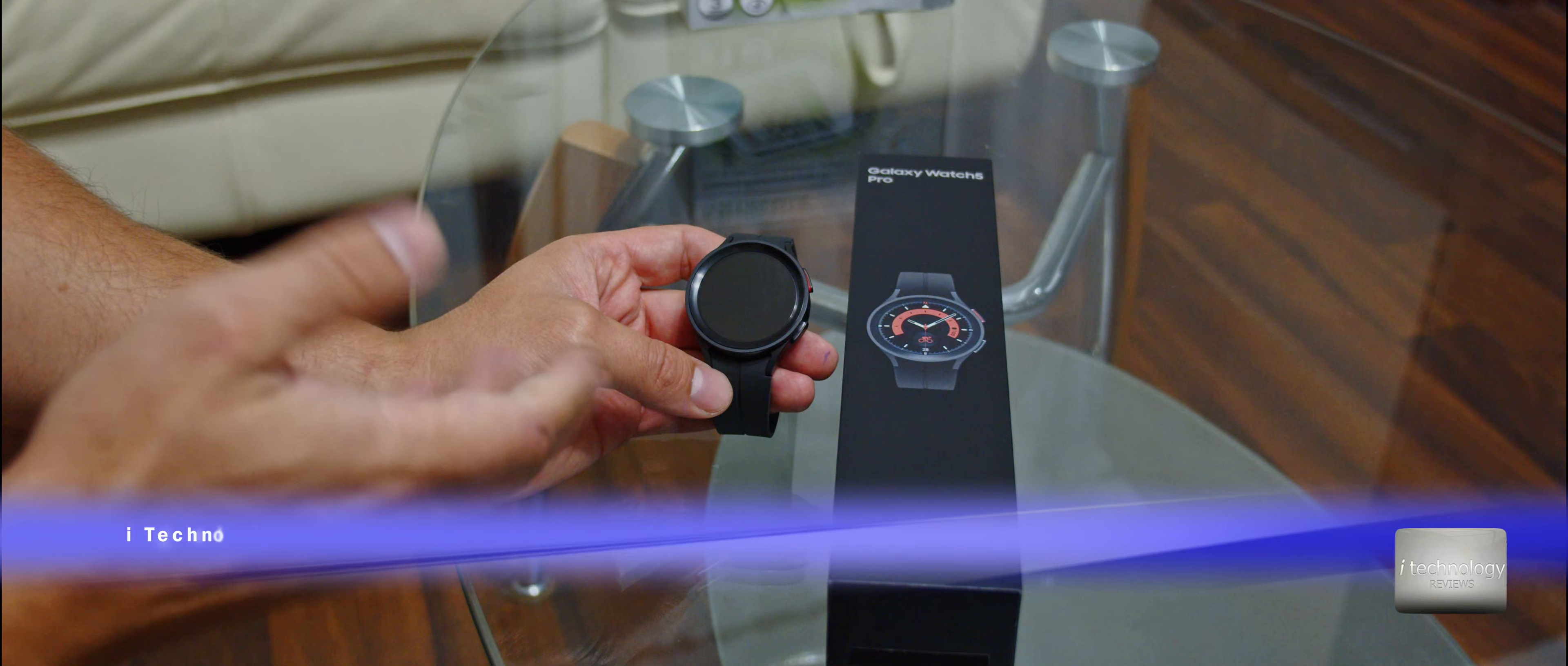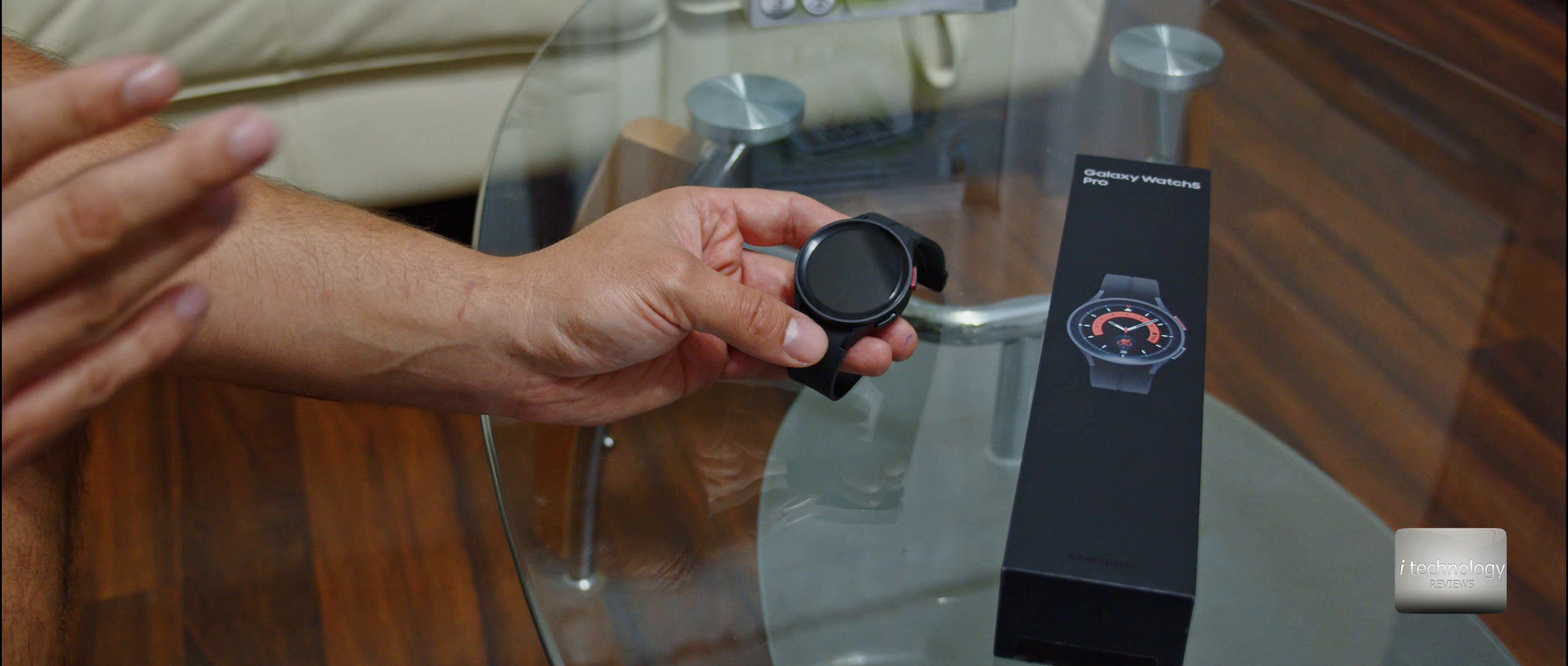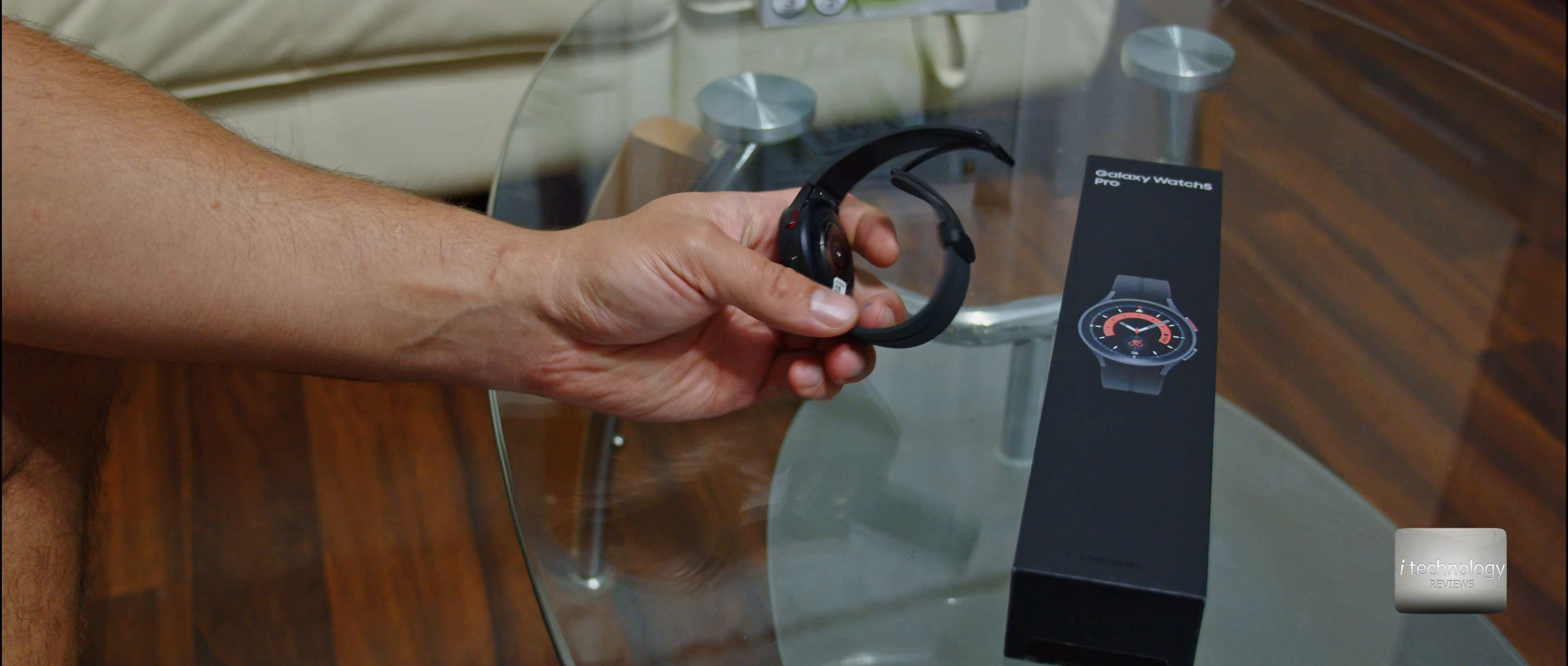The new generation of these smartwatches are capable of measuring blood pressure. It's a blood pressure monitor and also has the ECG function. It has a lot of medical features. These functions are available not only for the Pro version, the normal versions will have them also. It doesn't need to be the LTE or the Pro version.